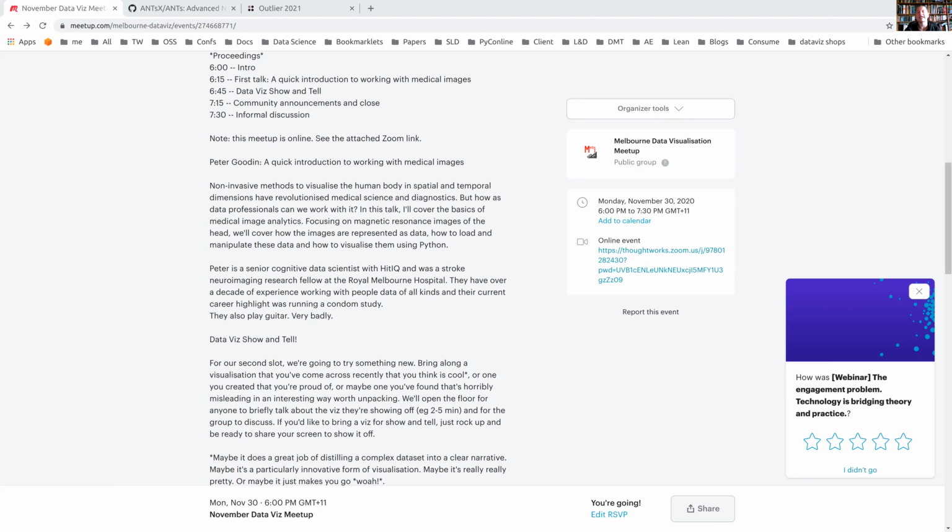That being said, it doesn't necessarily have to just be for medical images. ANTs actually has a very nice tutorial. They don't suggest you do it, but you can. They take two pictures of cars of completely different shapes and warp one of the cars into the shape of the other one, not losing any information. So in theory, these tools can be applied to uses outside of neuroimaging.